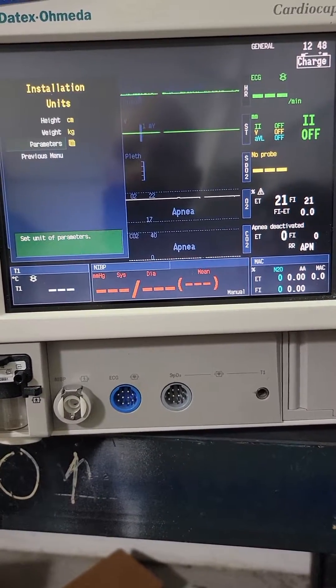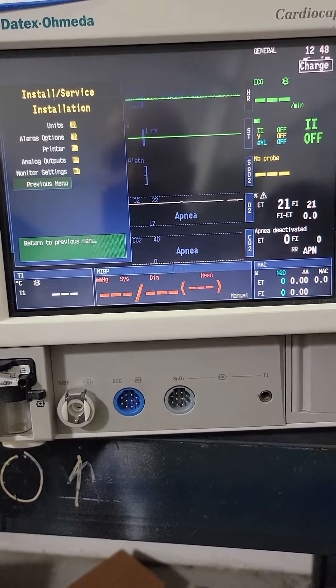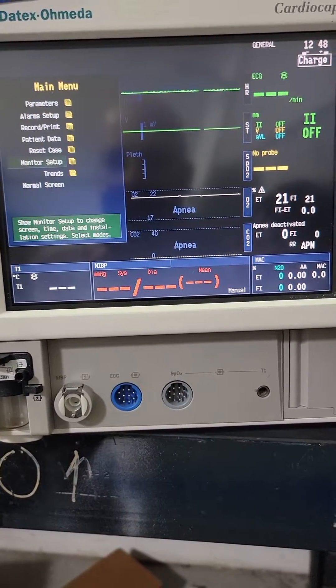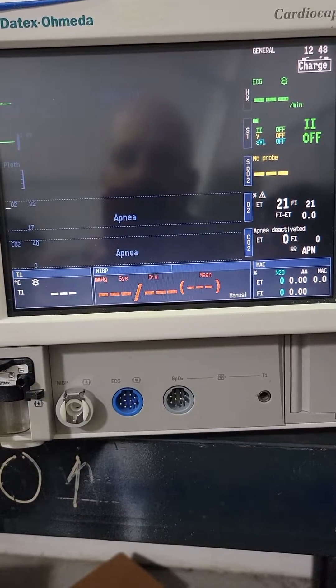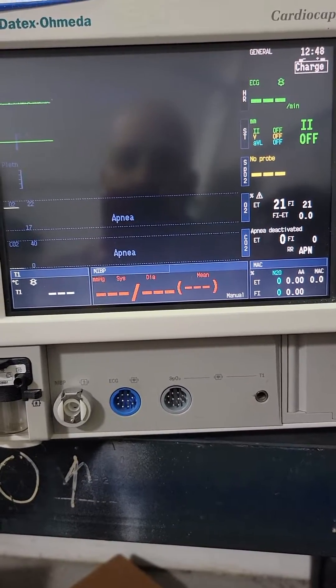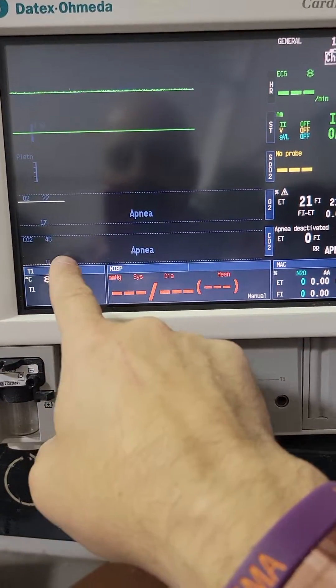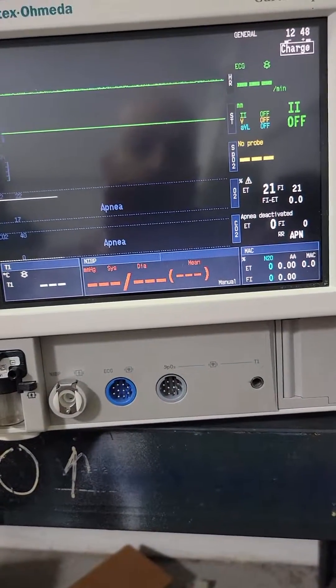I wouldn't worry about that. That's it — and then back out through this. This is the process for saving, not just pressing a normal screen button. And that's where I need it to be. That's it.